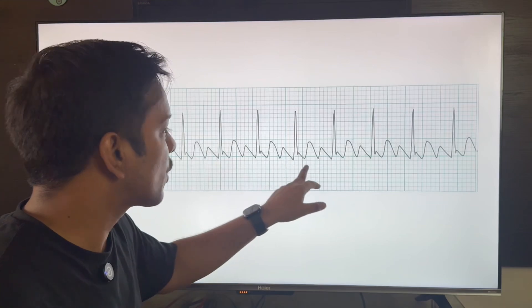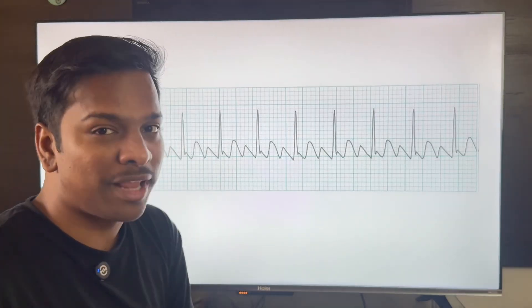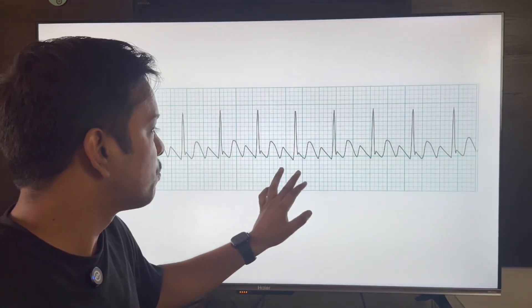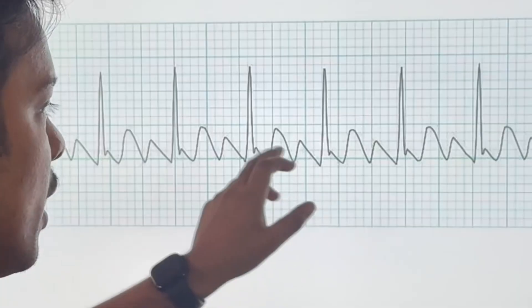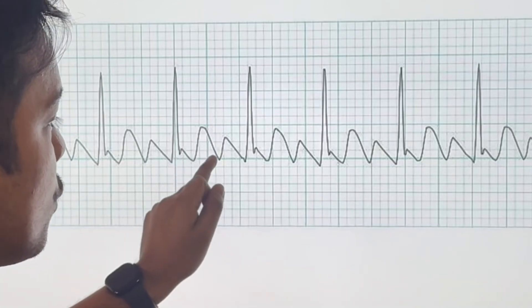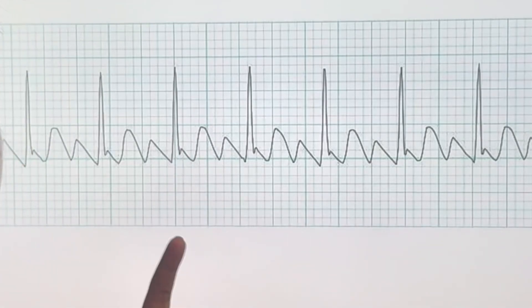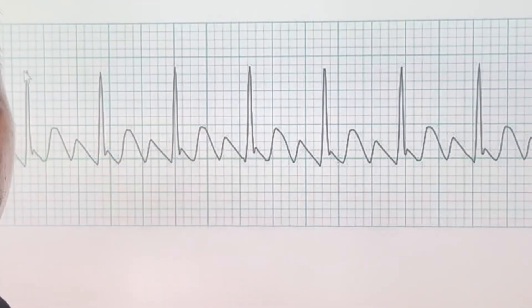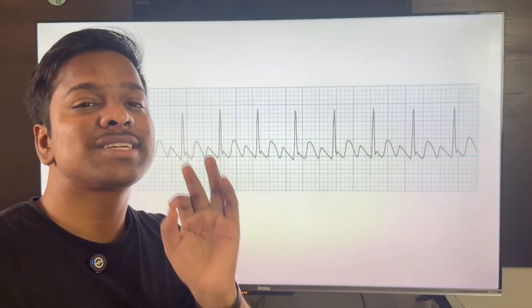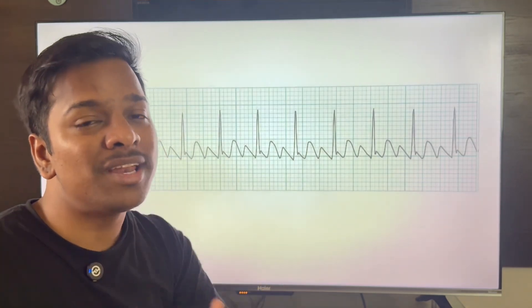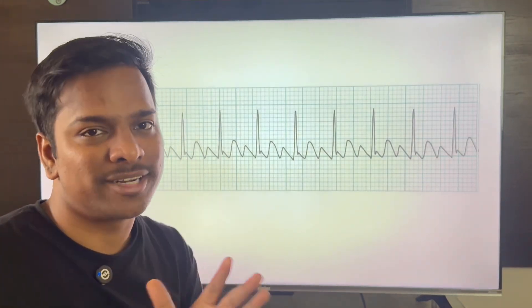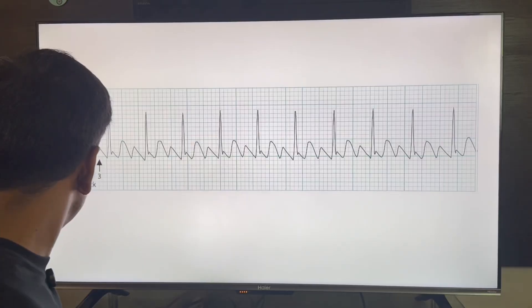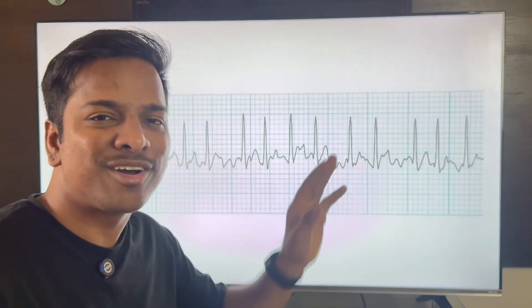In this interesting ECG, we can see sawtooth-type P waves. If you notice carefully, there are 3 P waves for every one QRS complex. This is classically known as 3:1 atrial flutter.